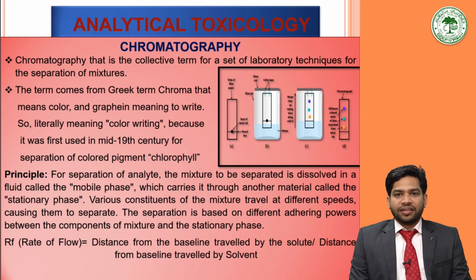Then chromatography. Chromatography is the collective term for the set of laboratory techniques for the separation of mixtures. The term comes from the Greek words chroma, meaning color, and graphein, meaning to write. So the literal meaning of chromatography is color writing, because it was first used in the mid 19th century for the separation of color pigments like chlorophyll.